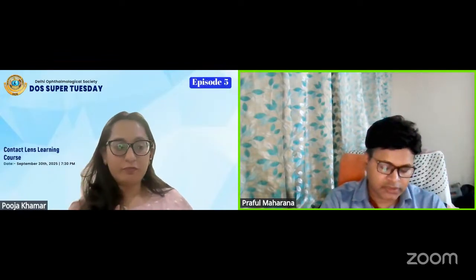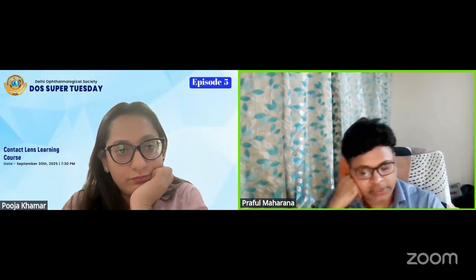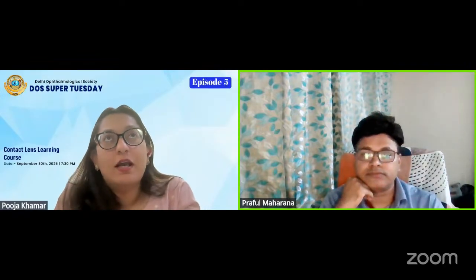So, Dr. Pooja, one question is, is it practical to follow all the DEWS criteria and tests in a busy OPD while managing dry eye patients? The basic, as I said, it's a must. Schirmer, TBUT has to be done. Look at the quality of the meibomian secretions, and the tear meniscus height. So that will tell you what direction to look at.